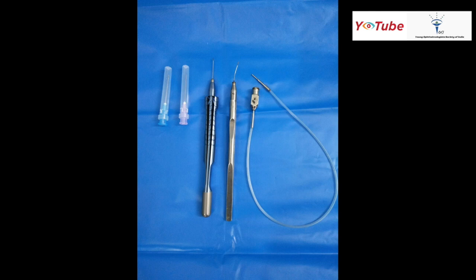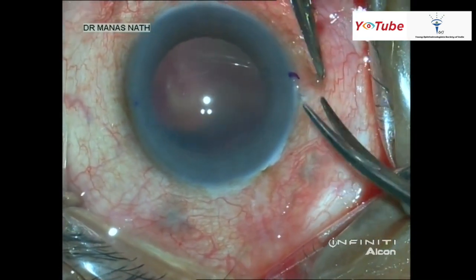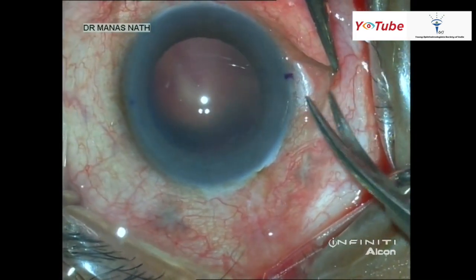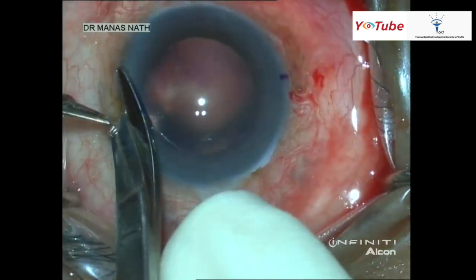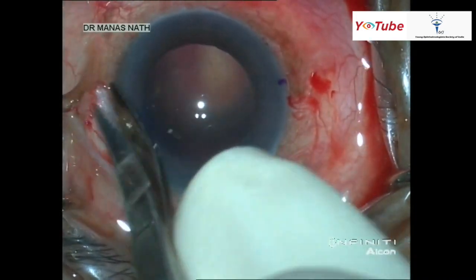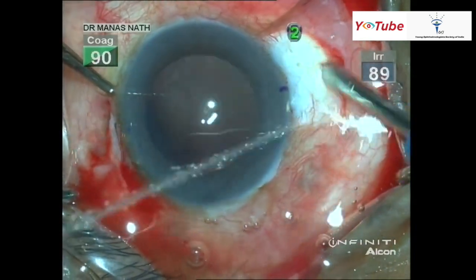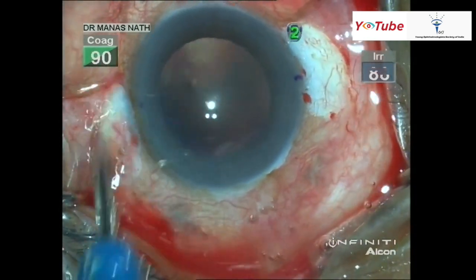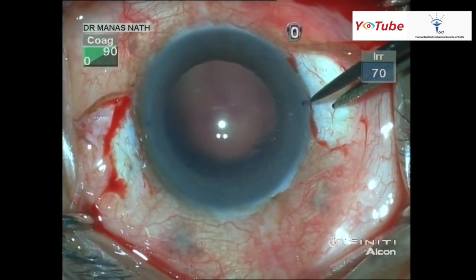Then a 23 gauge needle for making the scleral tunnel. Here I'm marking the center of the cornea on the operating table, and then doing a small conjunctivotomy which should be done on both sides, exactly opposite to each other. Gentle cautery is being done on both sides. I usually mark 2 millimeters from the limbus for the sclerotomy.